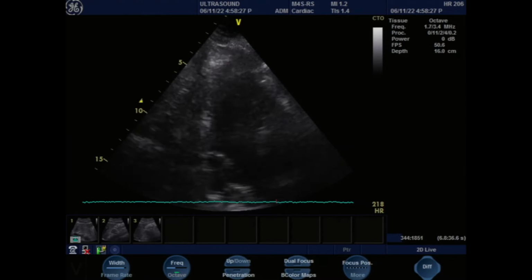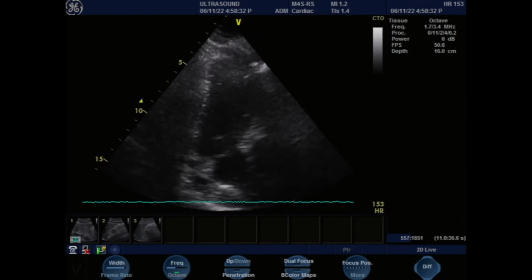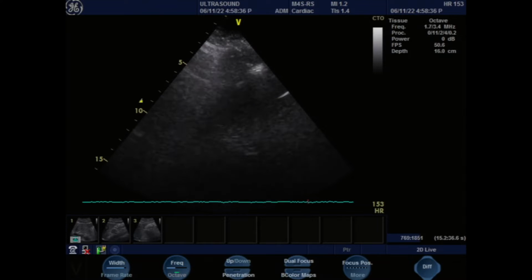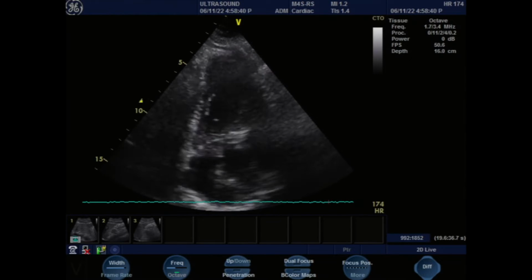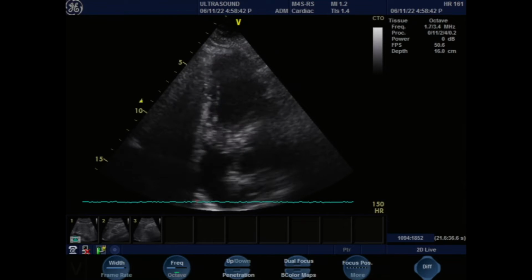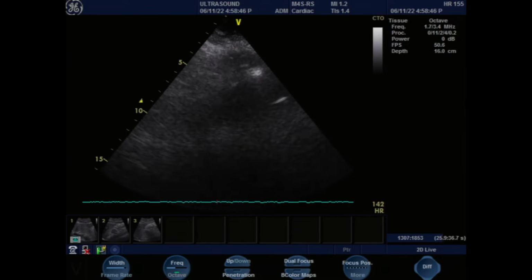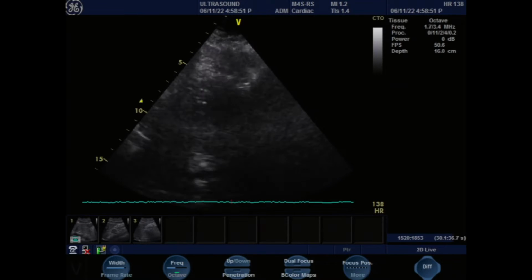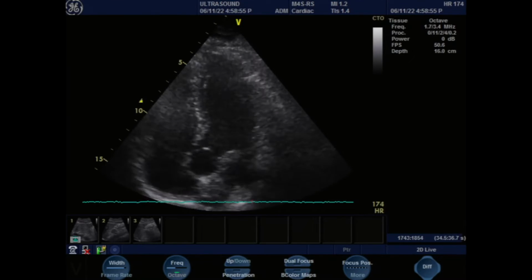So what we're looking at over here, on that side, this has got a good mitral valve. On this side we're looking at the right ventricle. When we're looking over here, we're kind of going in and out because of breathing, and then we're looking at the left ventricle over here. Right? And then we're also looking at the mitral valve here. And we're looking at the left atrium over here. Okay? So now, let me try to see if I can get a better image of this.